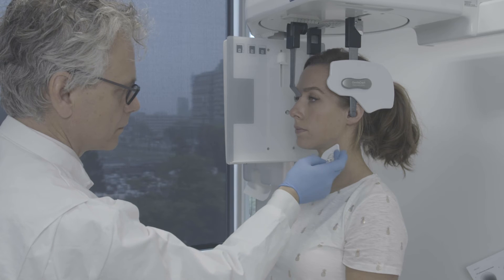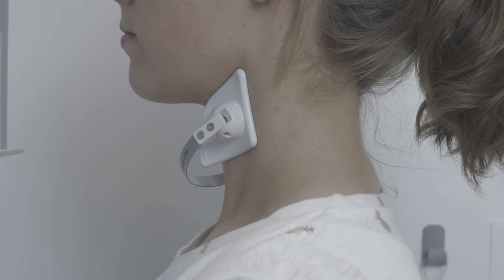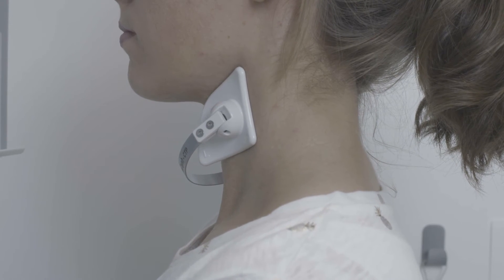Then we check that the upper corner of the shield is still positioned correctly below the corner of the mandible. The thyroid shield is now positioned correctly.